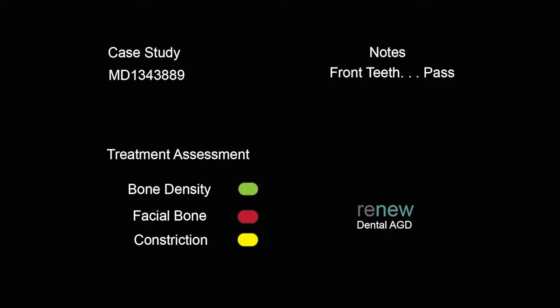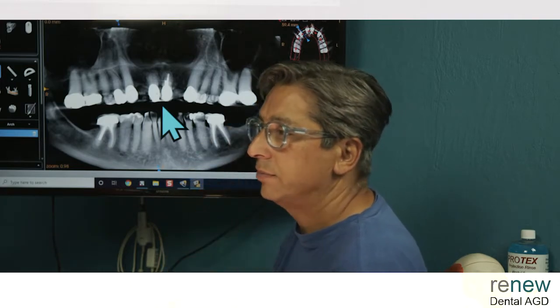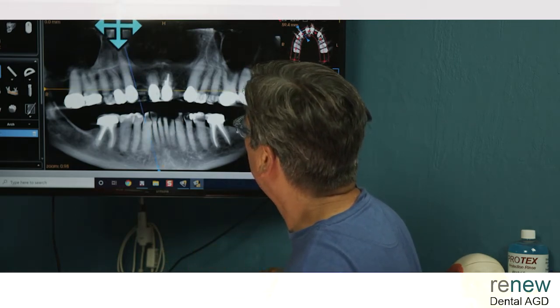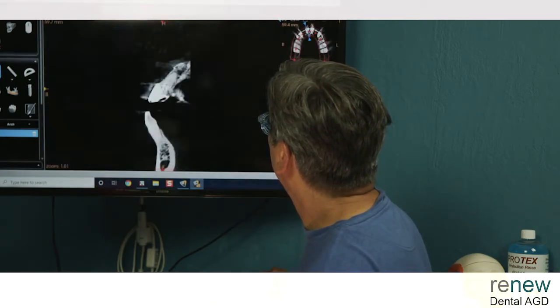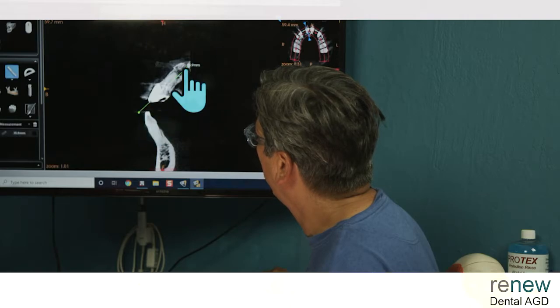The constriction actually isn't bad, but when we get to the facial bone and the flare, those are both in the red. So he has this really, really heavy orthodontic flare of his teeth, just like this. It's really just too hard to try to get anything stable that way that's going to stay in. And let's look at that right here. I'm going to go right around number 8, and you can see what I'm talking about. So this is what I'm talking about in terms of the ortho flare.